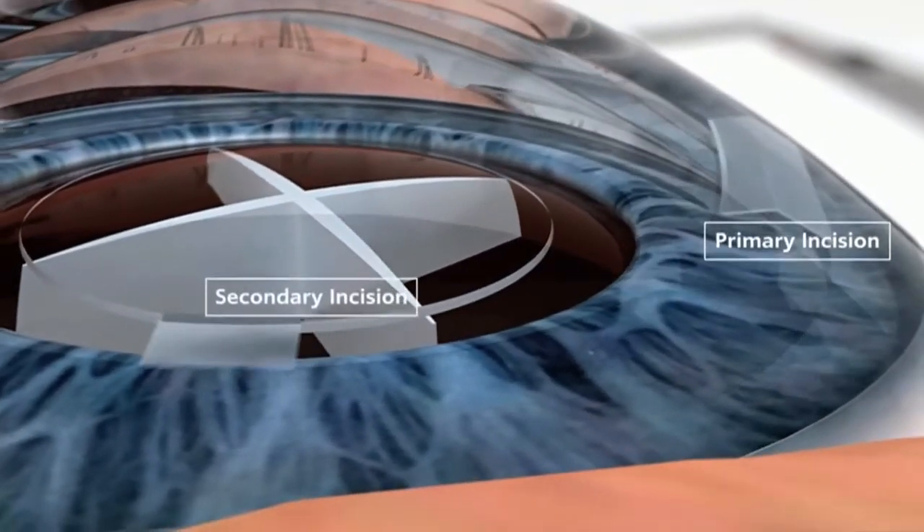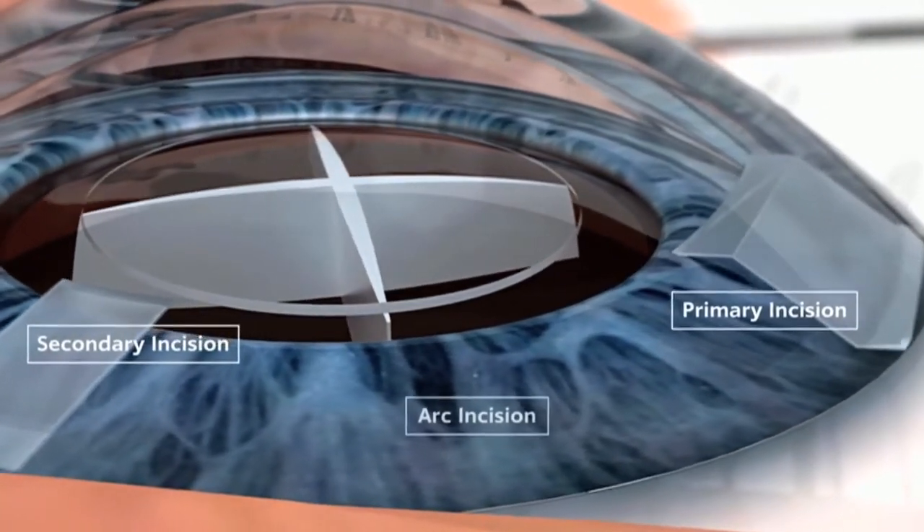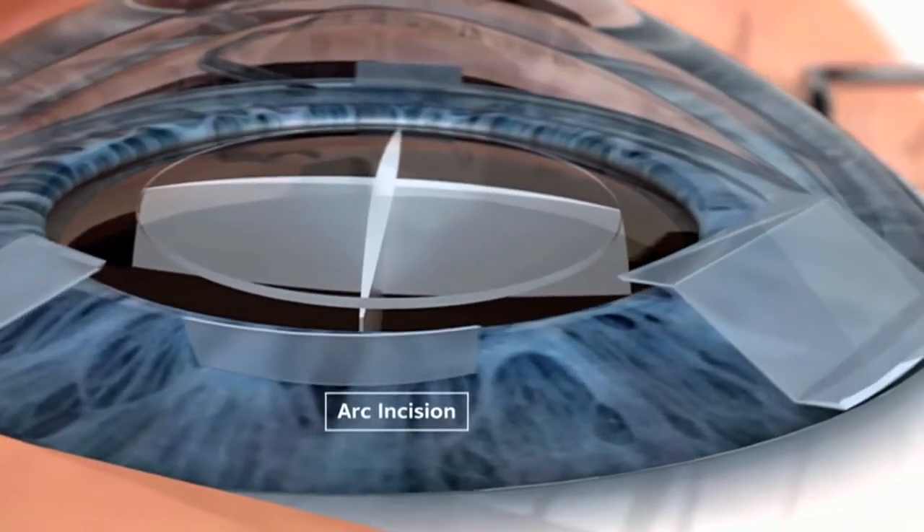With the laser under the image guidance system, it can consistently make that opening circular almost 100% of the time the way that we want it. It's also going to allow us to make the incision on the cornea a lot more precise — the shape that we want and the width that we want.